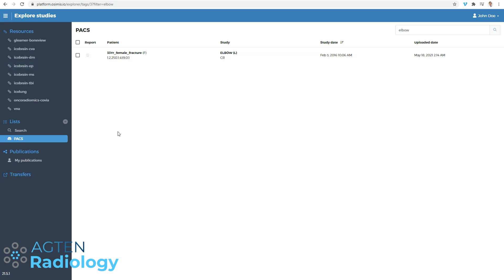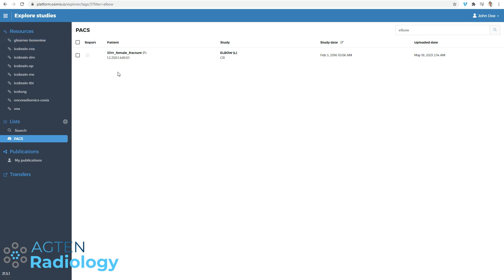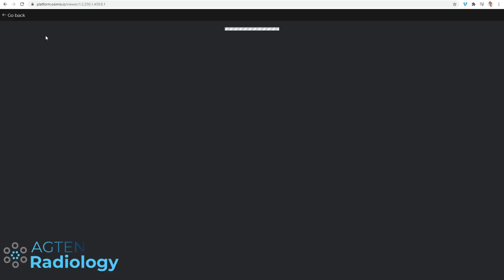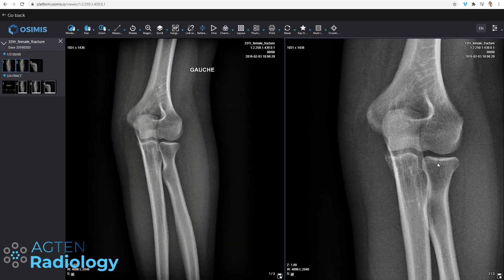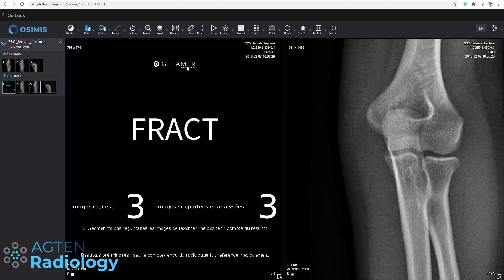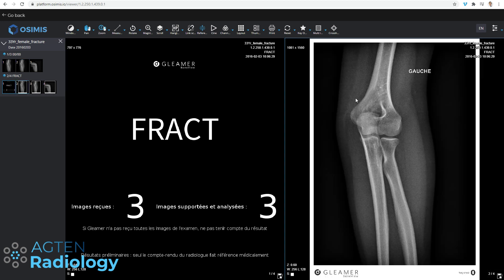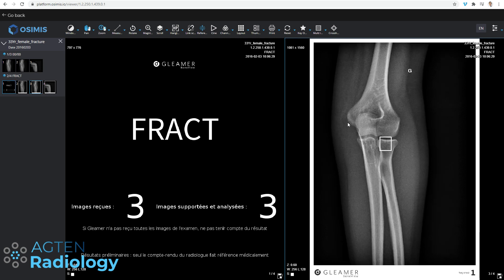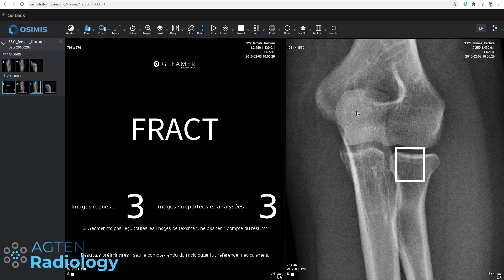Here we are in the CloudPACS by Osimis. This is their demo platform and it's quite nice because it has the Gleamer algorithm already included for test purposes. If you were working with this PACS system and Gleamer is activated, when you open a case — for example a female with elbow plain films — the result would already be here. We can see the fracture of the radial head. The algorithm provides this information with a bounding box showing where the fracture is actually detected, not just saying it's a fracture, but also showing where it's suspected to be.